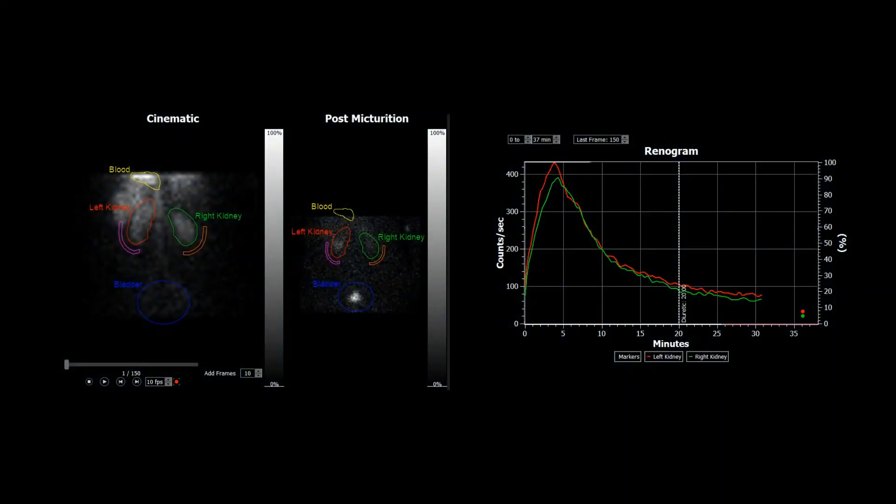If you have acquired a postmic static, that can be brought in aligned with the dynamic. And then the points just to the right of the renogram curve here represent the uptake in the kidneys at those points after the dynamic acquisition has finished.